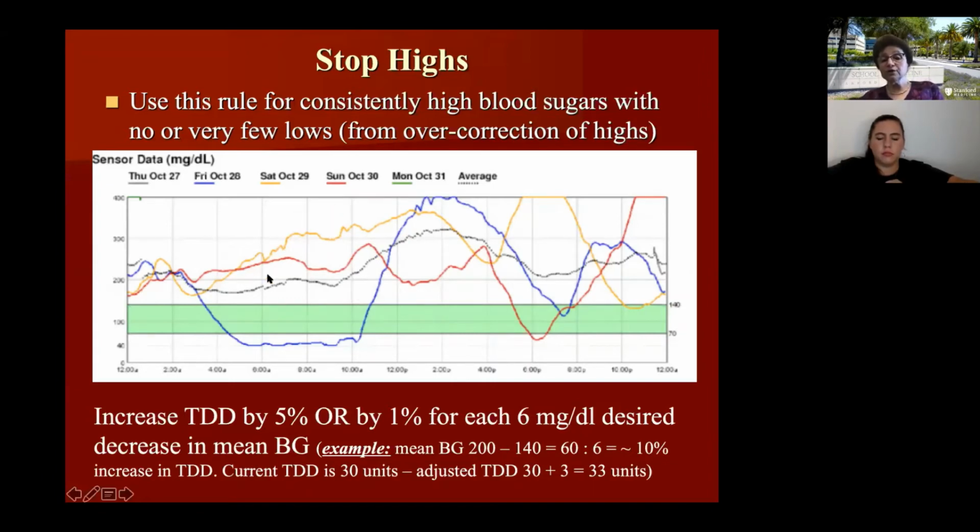So maybe I should start with increasing my total basal dose for the nighttime, nocturnal, to stop that first, to wake up with a good blood sugar, and then I can figure out if my prandial and postprandial numbers will be better.